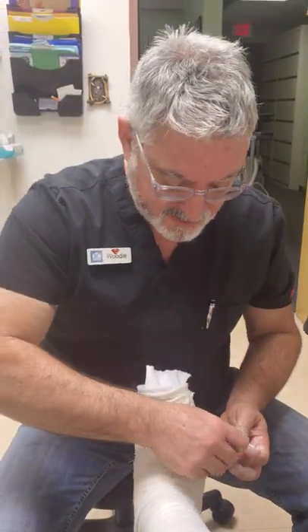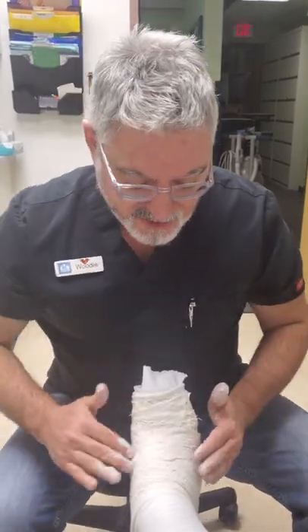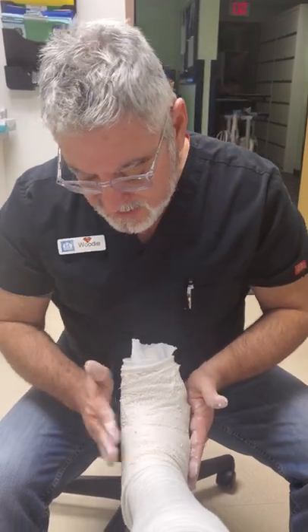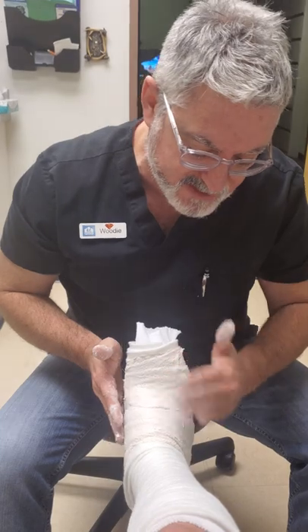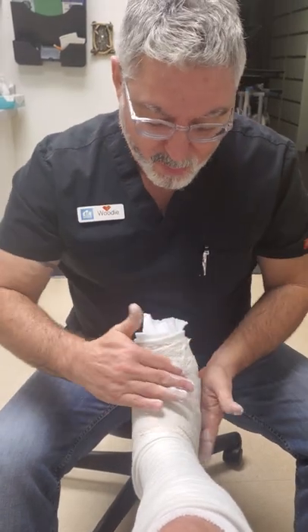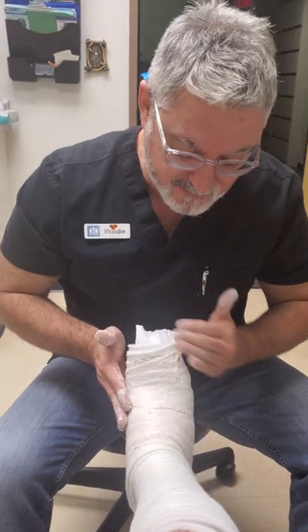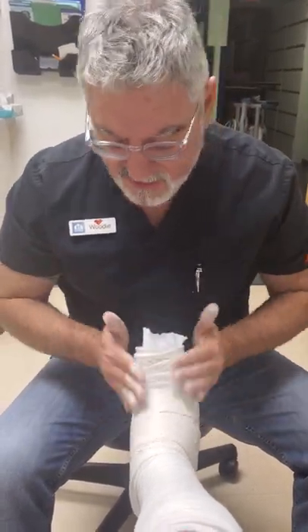You take the little end piece and just kind of lay it flat, then you work with the material and smooth it out. Now there is a slang term for this — you'll hear your doctors or surgeons use the word 'sugaring.' That is an actual term where you're basically smoothing out the roughness of the plaster and giving it that old-fashioned smooth white cast look.